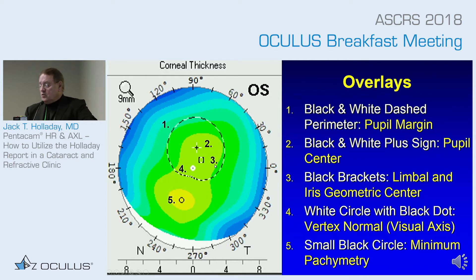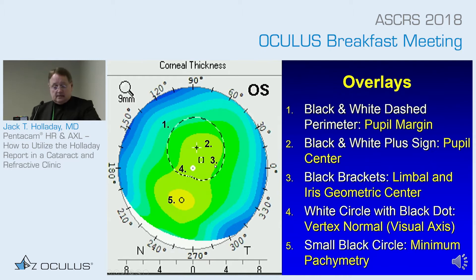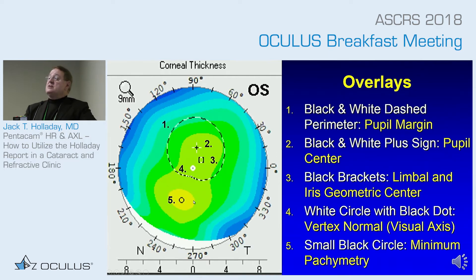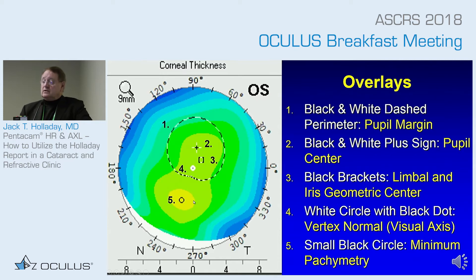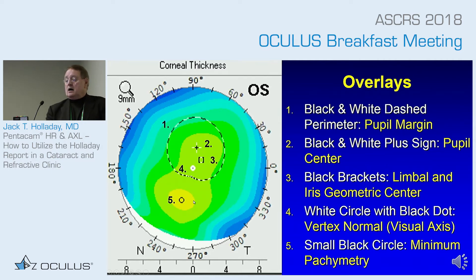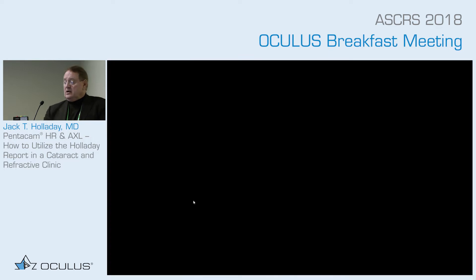The fourth overlay is a little white circle with a black dot in the middle — that is the vertex normal, or visual axis. The fifth is a small black circle at the bottom, which is the thinnest part of the cornea: the pachymetry minimum. So those five overlays are the pupillary margin, pupil center, center of the limbus, vertex normal or visual axis, and the pachymetry minimum location.